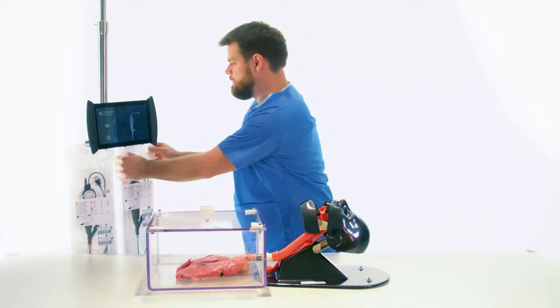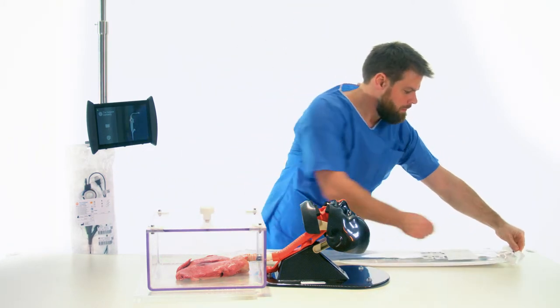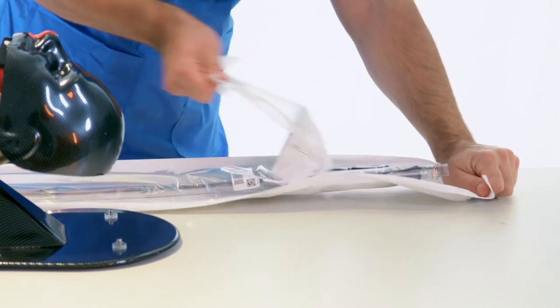For this procedure, a BroncoFlex Vortex with a 2.8 mm working channel is used for powerful suction.